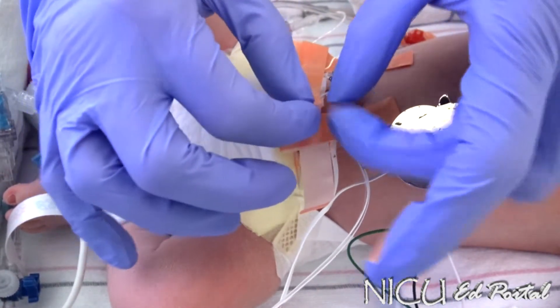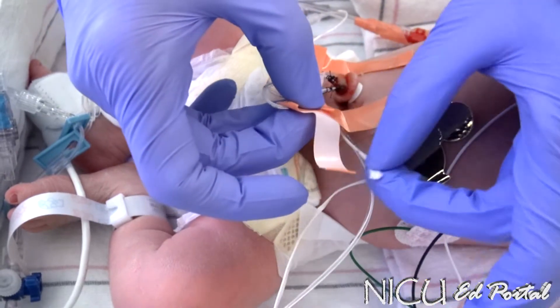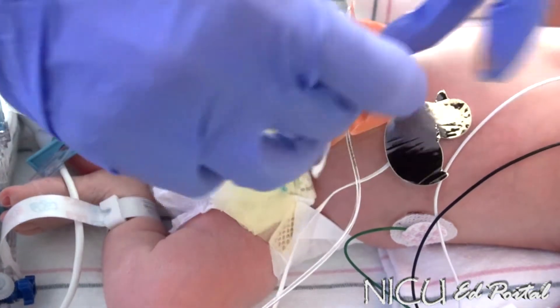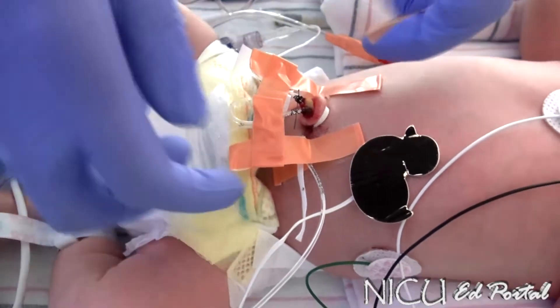I always leave a little lip so you can actually take the pieces off as needed or separate them. You always want to have a little bit of an air cushion.